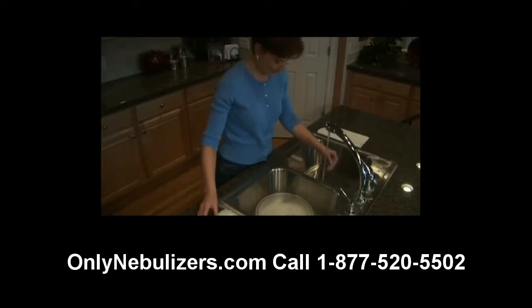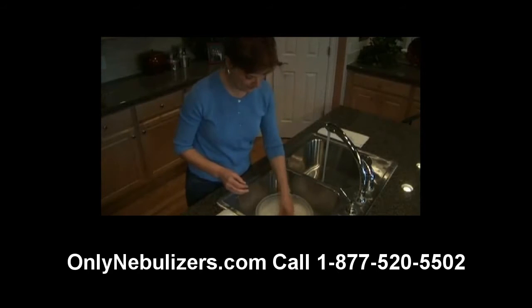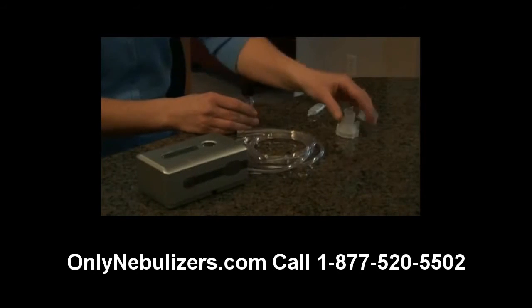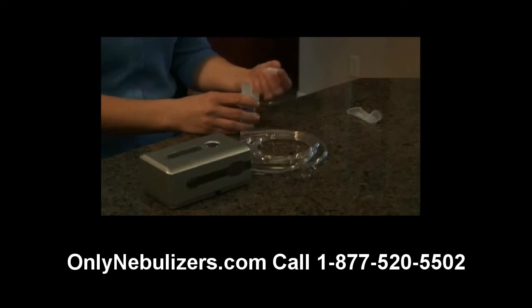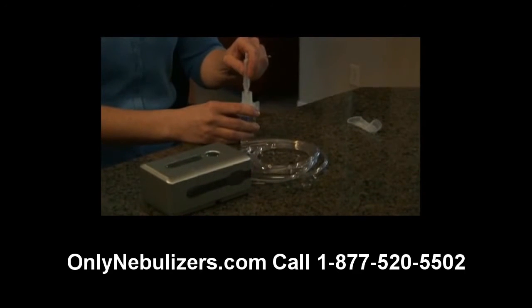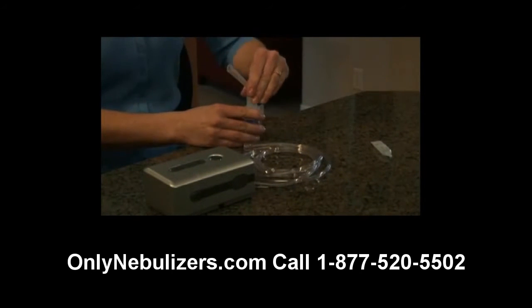Before you use your nebulizer for the first time, clean all parts by following the instructions provided later in this video. After washing your hands, insert the baffle into the nebulizer medication cup. While holding the cup, attach the nebulizer cap by turning clockwise. Next, add the prescribed dosage of medication into the nebulizer through the large opening in the top of the nebulizer cap, and attach the mouthpiece to the cap by pushing gently straight down.